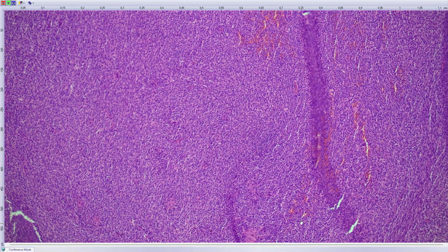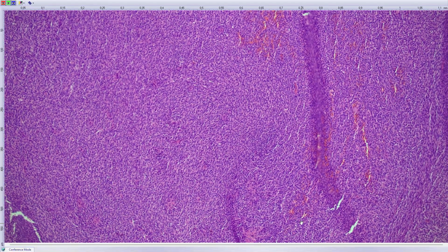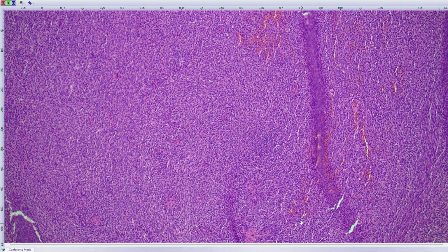And these tumors, interestingly, are always in adults. Why is it interesting? Because there's another group of rhabdomyosarcomas, which are basically a subtype of spindle cell rhabdomyosarcomas, and they have VGLL2 fusions, not 3 but 2. And these tumors are almost always in newborns and children under 2 years of age, so it's kind of fascinating.